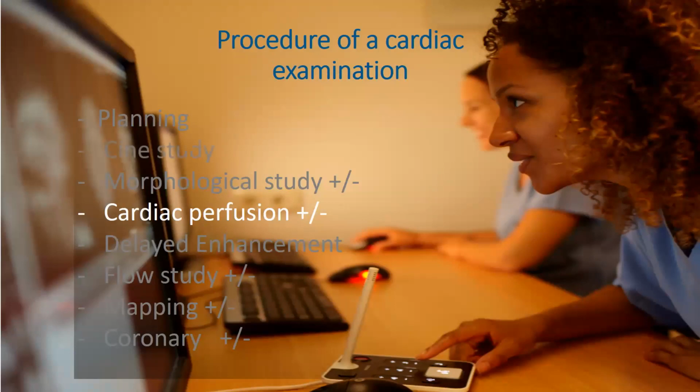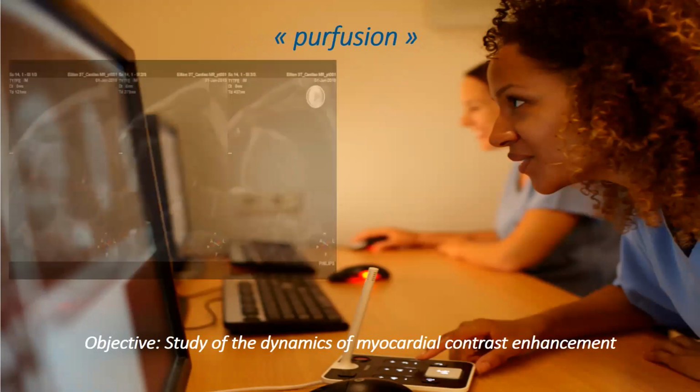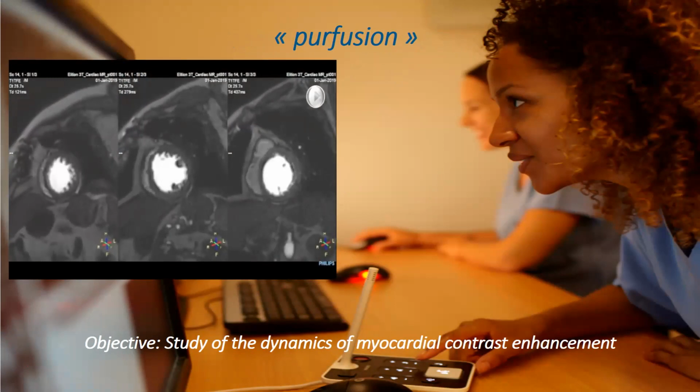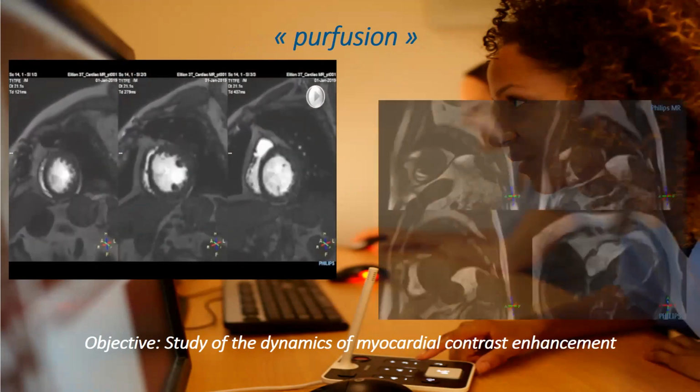For the cardiac perfusion, the objective is to study the dynamic of the myocardial contrast enhancement. We can see here the injection of the gadolinium, and we see in the images how it evolves during the sequence and the acquisition.